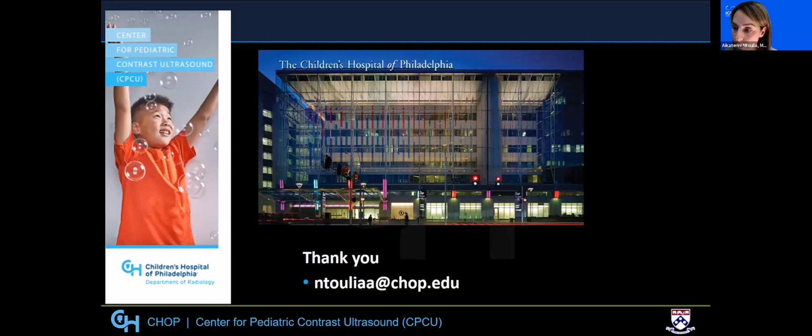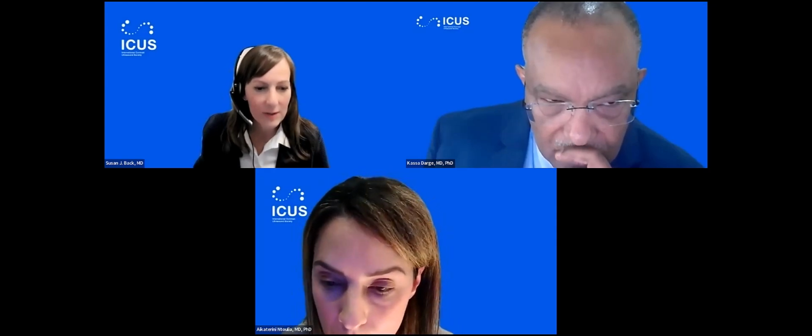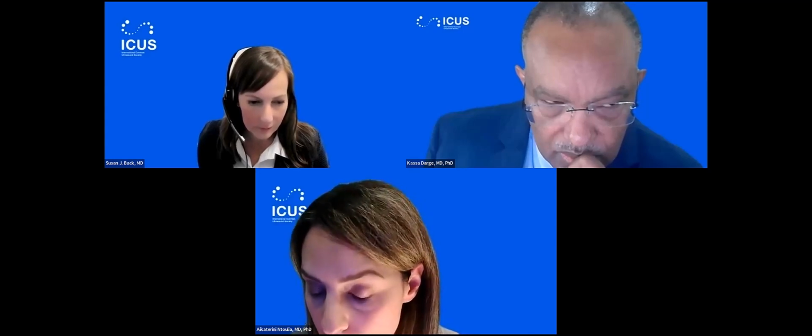Can you speak to the way that the institutions you've worked in screen patients ahead of doing contrast ultrasound? Screen them for risk of reactions? Yes, so before CEUS exams, there's a discussion with the patient or caretakers about known allergies, suspected allergies, any type of allergies. And since the revision of the package insert, a discussion about allergies to bowel preparations and laxatives is now included. So, standard discussion about allergies.